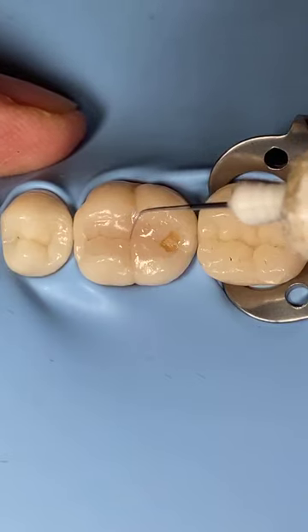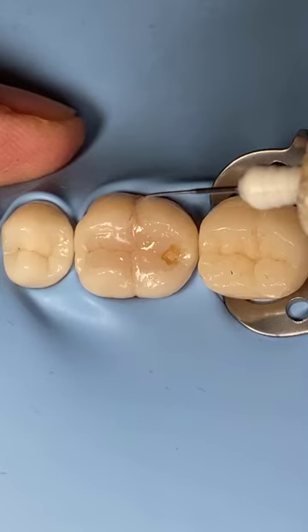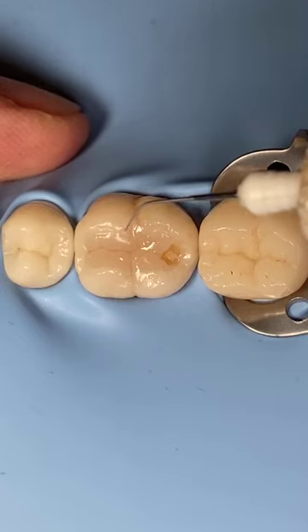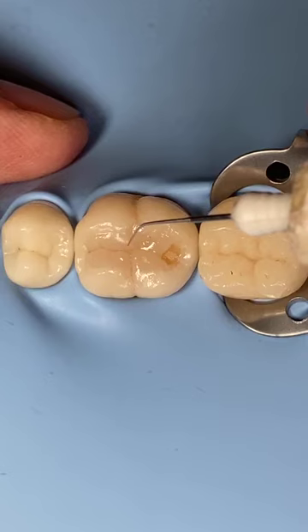Remember, create a gap with the dot technique. After this live, remember the dot technique. Maybe in your sleep you will be dreaming about the dot technique. Just remember the dot technique or step technique.